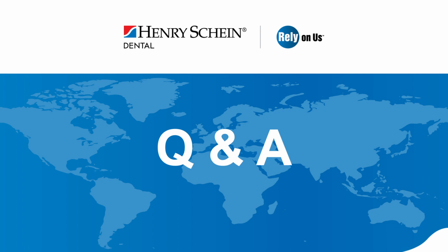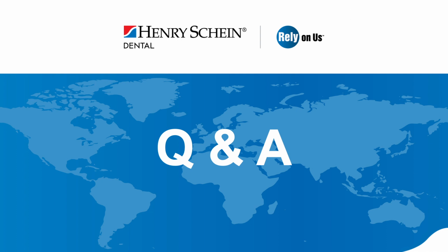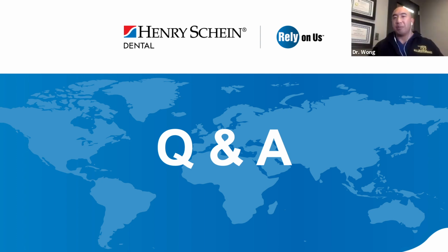Is a torque test only for screw retained implants? No, the torque test is for any implant. Can you explain timing after placement for use of Osstell? So you can do it anytime. You can do it at the time of implant placement, if you're thinking about immediately putting a provisional on and loading it even. You can do it a month after. You can do it at any point. As a matter of fact, that's what it's designed to do, to show you the increase in stability over time. That's the whole purpose of it.